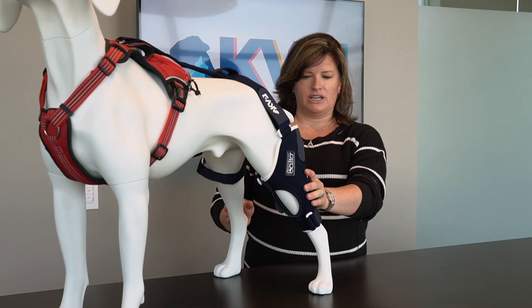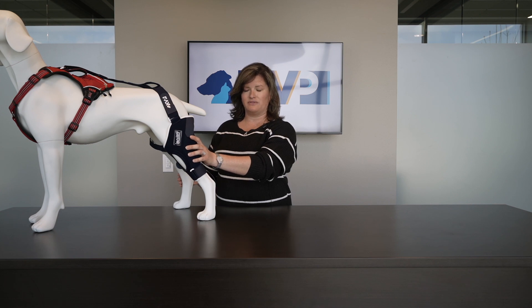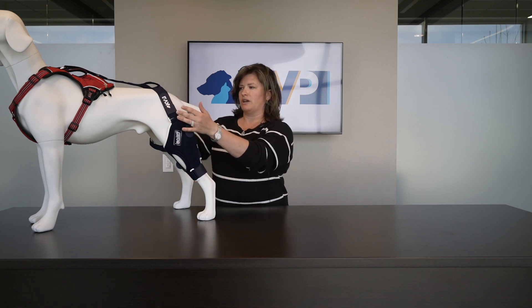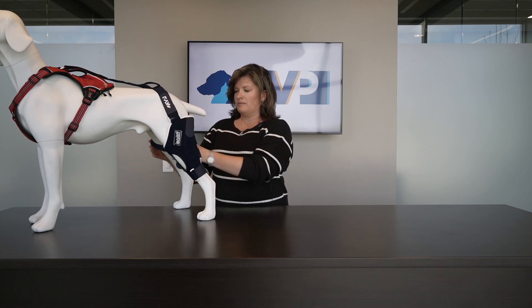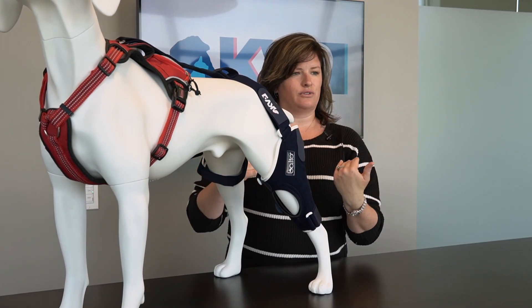As you can see on this patient here, we have a couple of different ways that we can apply this brace depending on male or female anatomy. With the male anatomy, we actually have the brace on the left knee here with a strap that comes up over the back of the hip, and there's an anchor strap on the right leg. Now to keep this strap from sliding off over the tail, we're actually going to attach another strap to a harness. You may see on some propaganda or with some of your friends that it's attached to a collar, but the patients are far more comfortable if you put this anchor strap on a harness — it's just a little bit more stable.